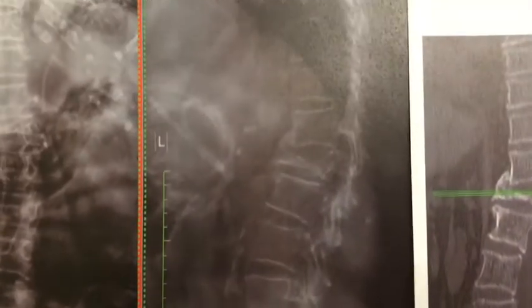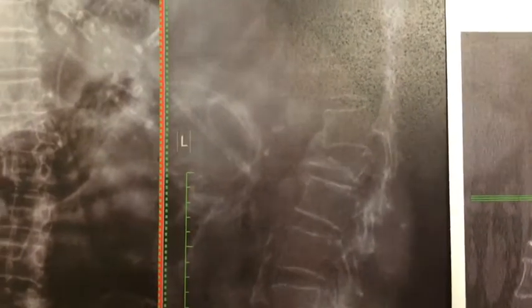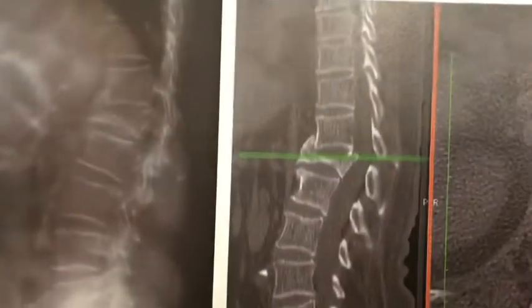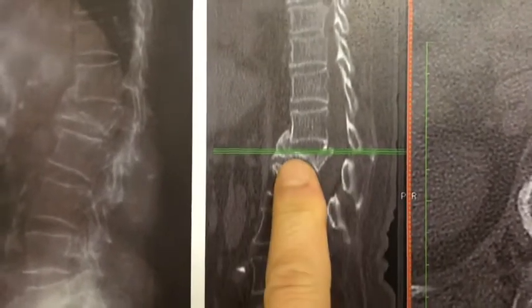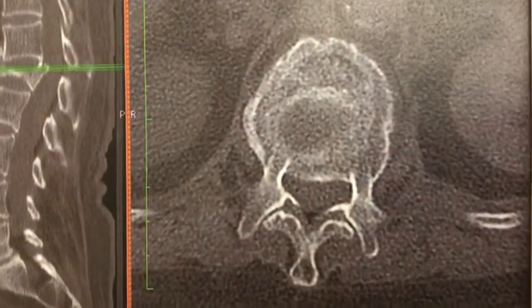The surgery for today is a complex reconstruction. This 74-year-old woman has an osteoporotic compression slash burst fracture. You can see this bone is completely collapsed. I think you can see it a lot better on the CT scan. The green line is obscuring the central area, but there's also a sagittal split component. You can see the pedicles are fractured at the vertebral body.